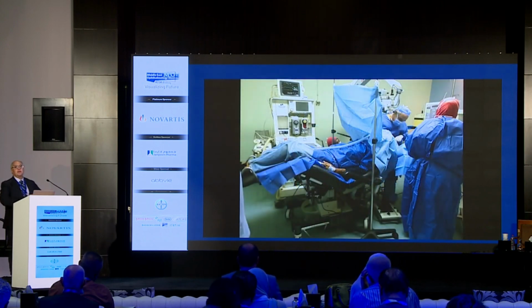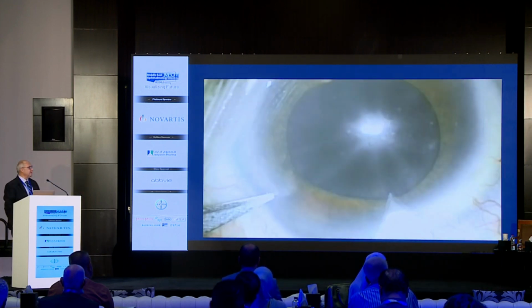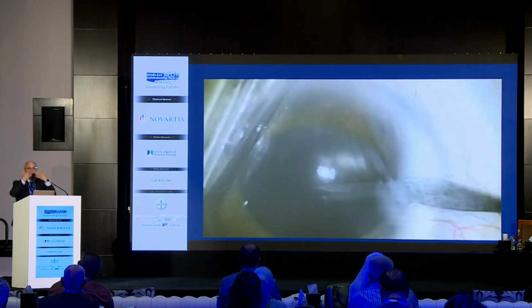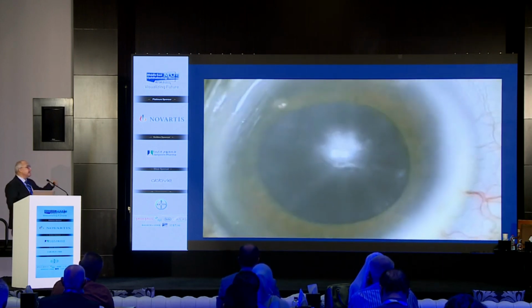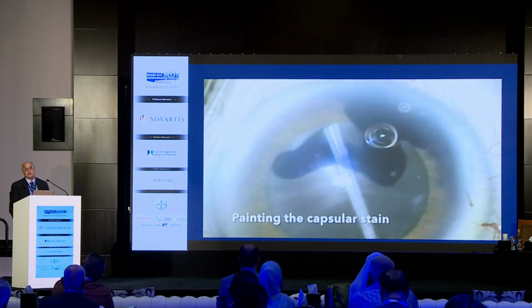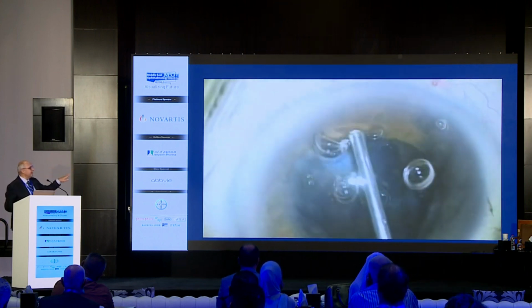This is an example of the most extreme case, a kyphotic patient that they have to work standing. This is the only position the patient can be positioned. But having a technique in your mind, and you can do it routinely, even in this case, I have to work standing. So I'm using one foot only, and I cannot change the microscope. This is the true black cataract.